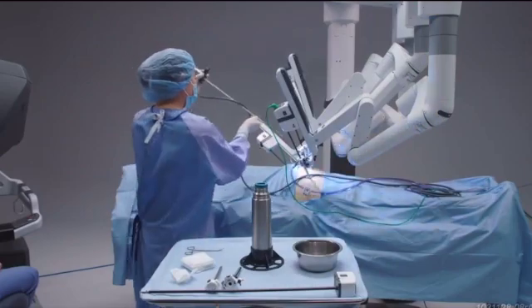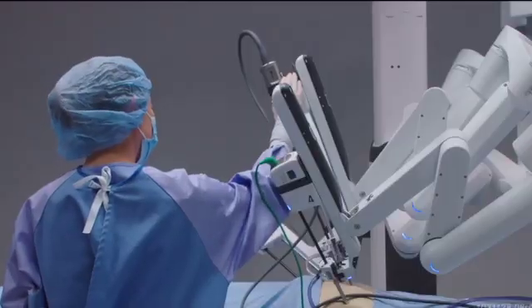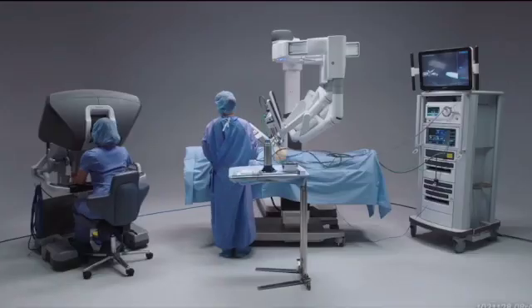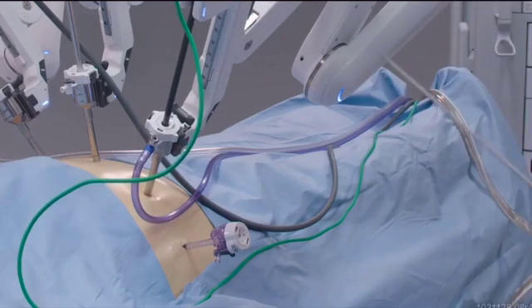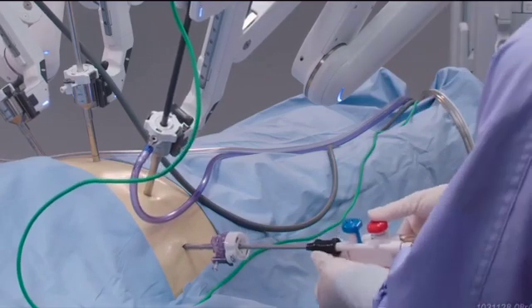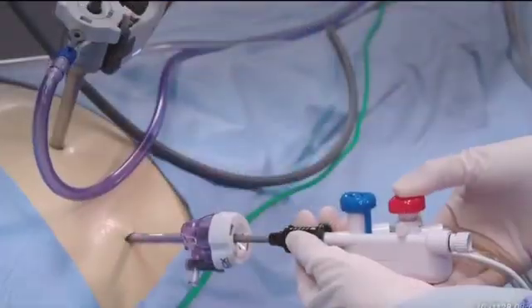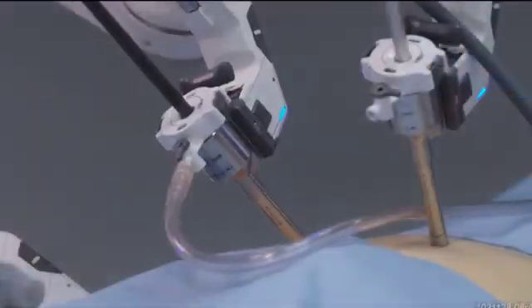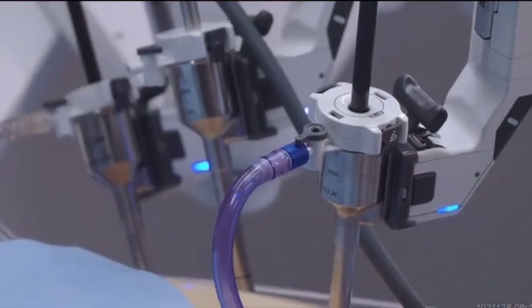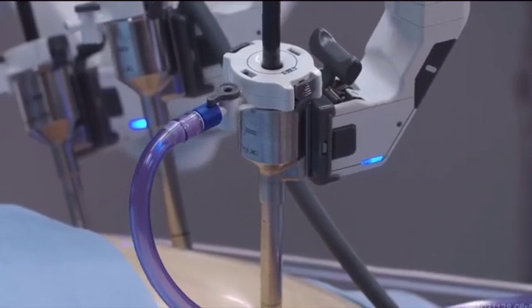To prevent disruptions from cautery smoke and endoscope fogging during the procedure, use an insufflator with heated insufflation and smoke evacuation capabilities, or use a standalone smoke evacuation product. Heated insufflation can help to prevent a temperature difference within the body cavity. Smoke evacuation systems, in addition to using short bursts of suction at the site, will help minimize smoke buildup. Connect both the insufflation tubing and smoke evacuation tubing to cannulas that will not be used for the endoscope for the majority of the procedure.